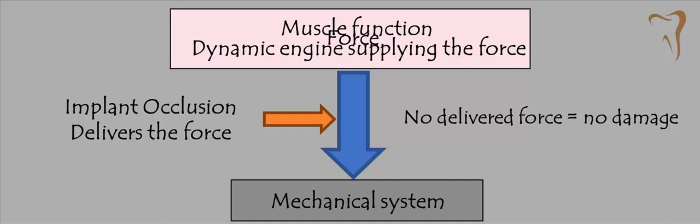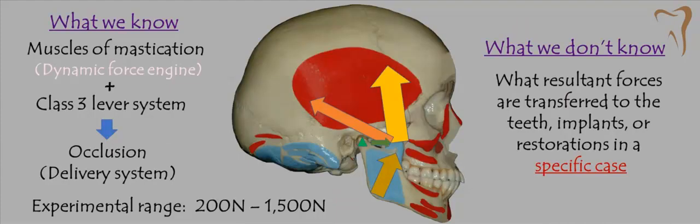So what delivers this dynamic load onto our mechanics is implant occlusion that delivers this force. And there's a lot of different aspects to this occlusion that does that. So let's take a look at Herman here.